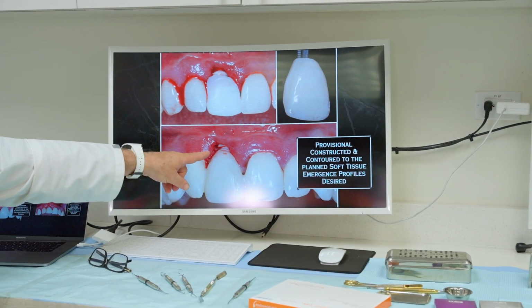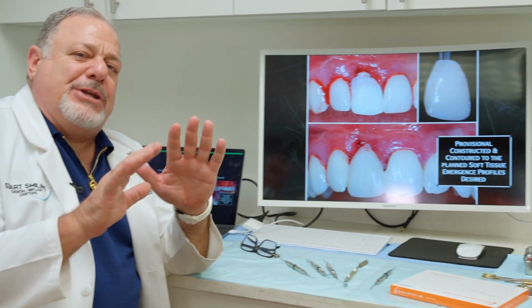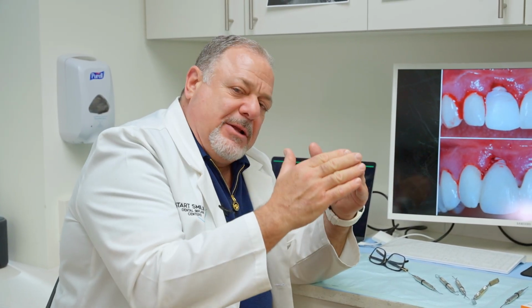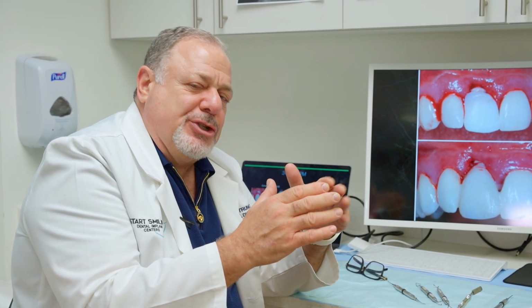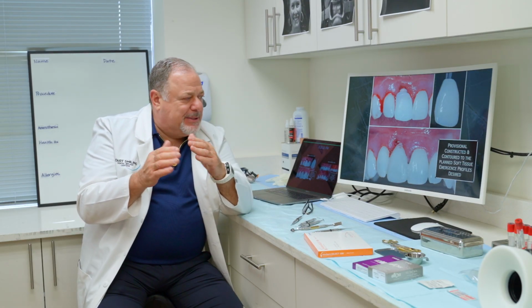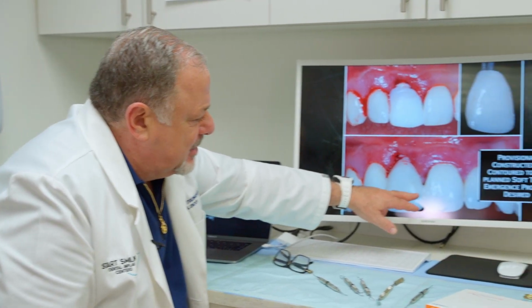And then I put my temporary in place, and I'm just going to bond it to the teeth on either side just for protection, because even though we've got good mechanical integration of the bone, there's nothing on the facial. So if she has a tendency to go, she could literally give us a little bit of a jarring of the implant out in a very easy space because she's got a deep overbite. So we'll end up just flicking this off down the line.